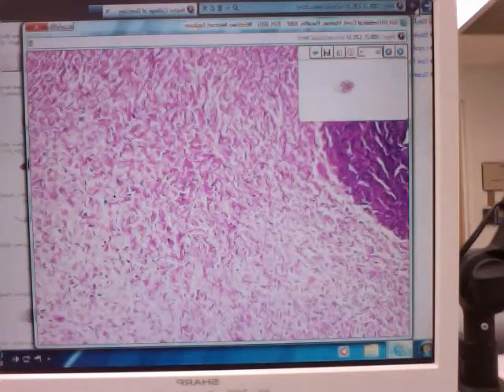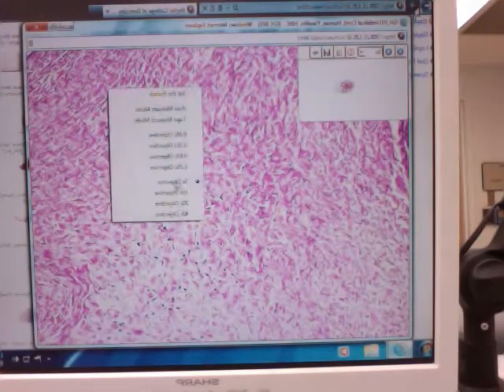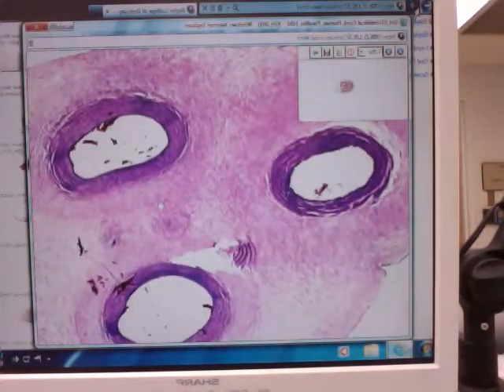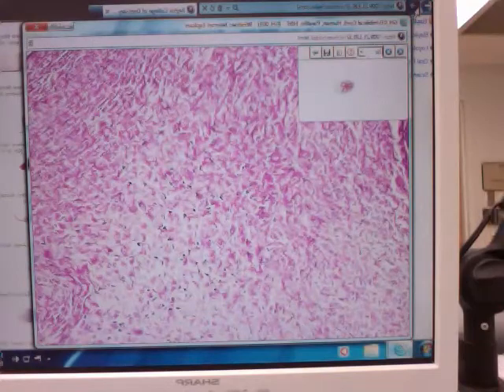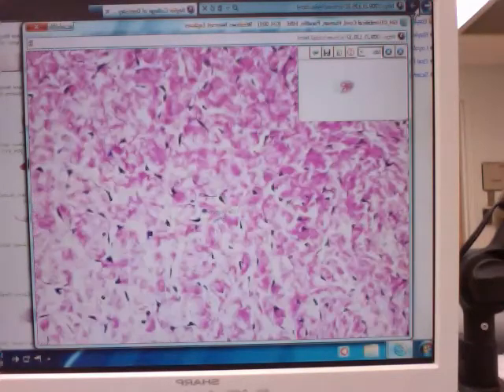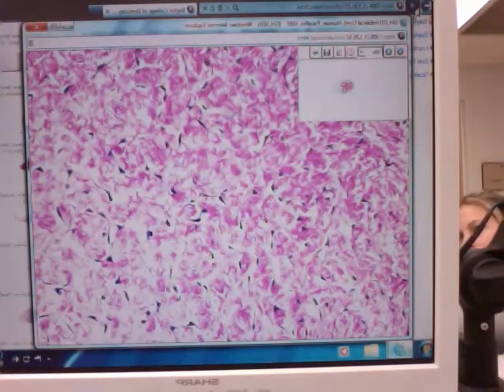Okay, here is another type of connective tissue. This is one where you just got to get familiar with this slide. It's one where all these cells are fibroblasts, fibroblastic in nature, with collagen fibers scattered throughout it. At first glance, you might think it's dense irregular because you've got all these bundles of collagen fibers.